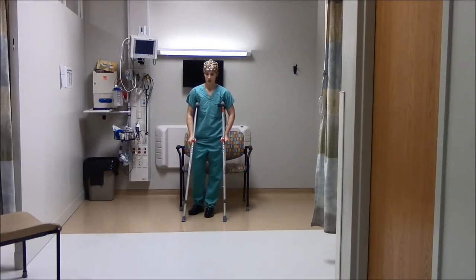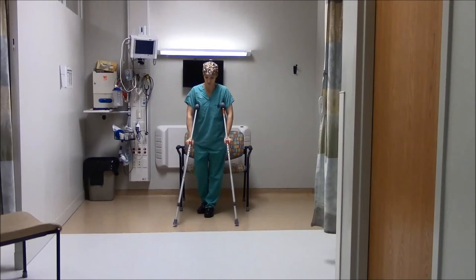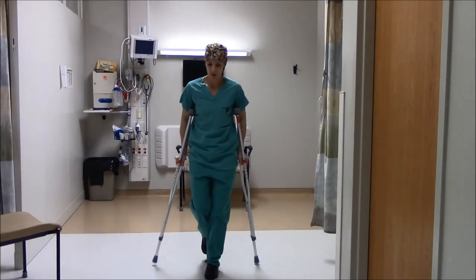Move the crutches ahead of you approximately 12 inches. Push down on the grips as you step slightly past the crutches, leading with the good leg. Advance the crutches forward approximately 12 inches, then continue.